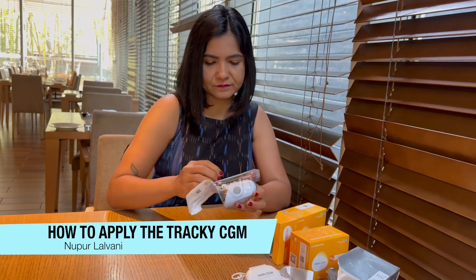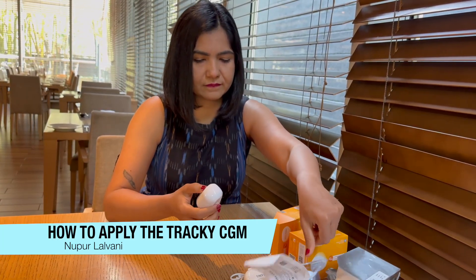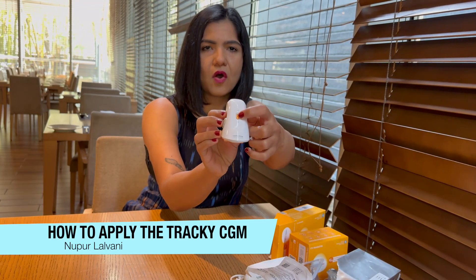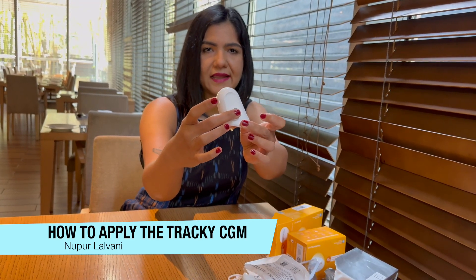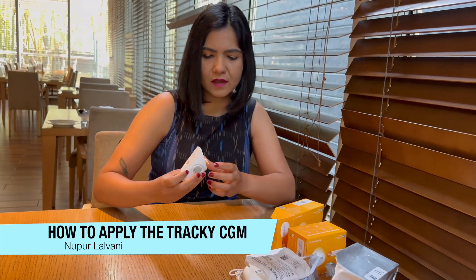So this is the applicator. You can see it's got a lock button here — the orange thing is the lock button. These gray buttons on the side are the buttons that you will need to press when you want to apply it on your arm.